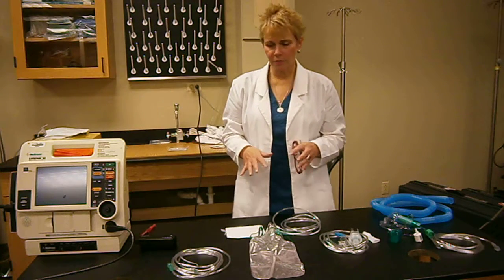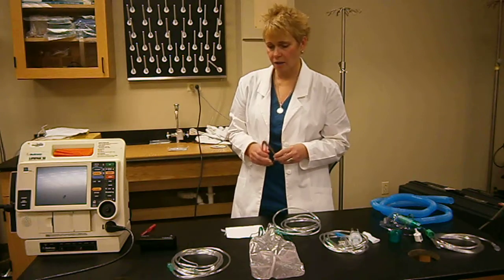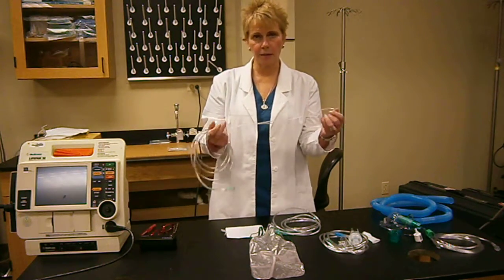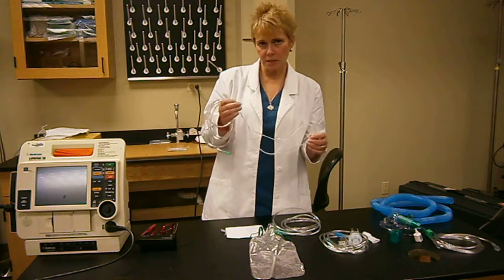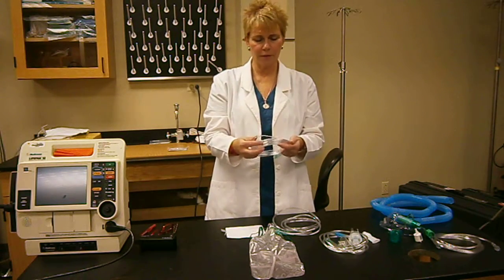I just wanted to take a few minutes to go over oxygen modalities in titration and weaning of oxygen. So we're all familiar with the oxygen, the nasal cannula. It should be used at 0.25 and it can be used up to 6 liters, and it can be hooked up to humidification once you're at about 4 liters.